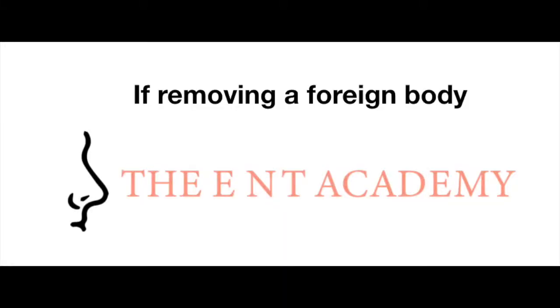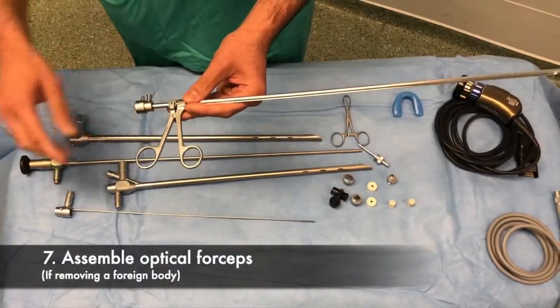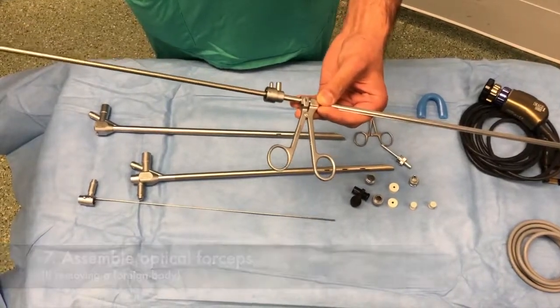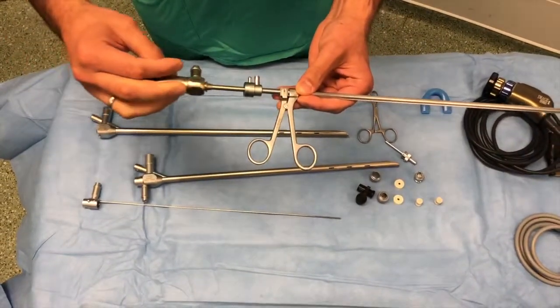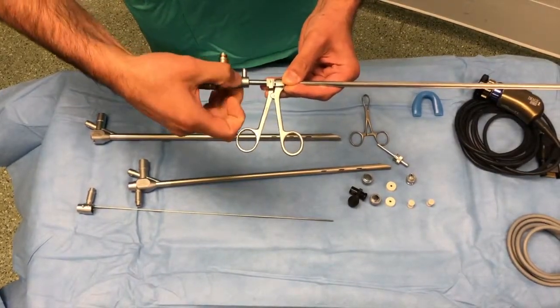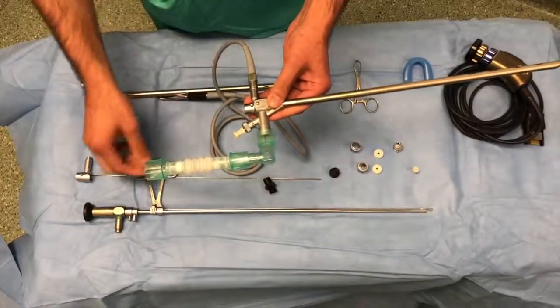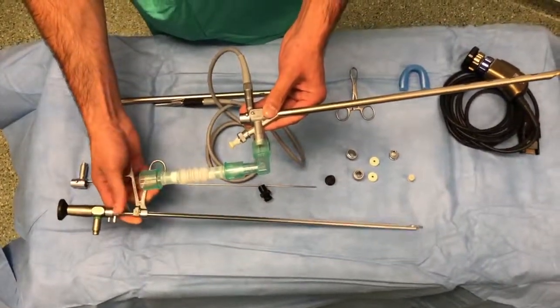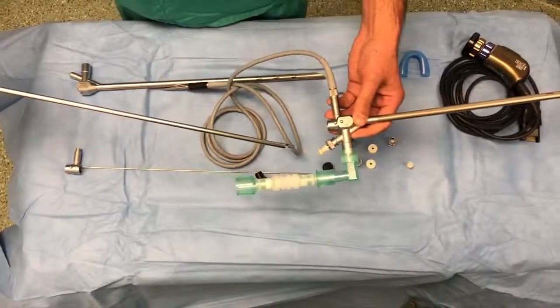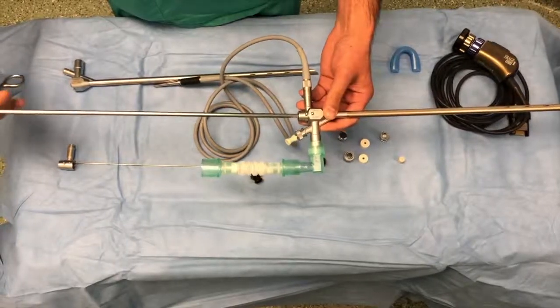If removing a foreign body using the adult bronchoscope, the optical forceps need to be assembled. The Hopkins rod is passed through the center of the optical forceps, aligned and locked into place. The bronchoscope, assembled as before but minus the Hopkins rod, can have the optical forceps along with the Hopkins rod inserted through the central port.